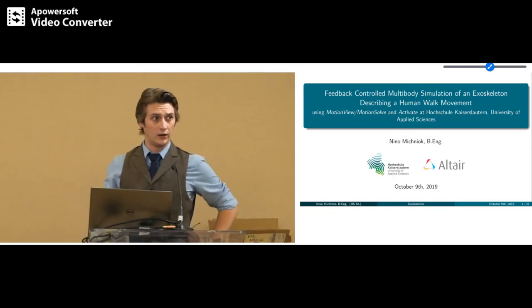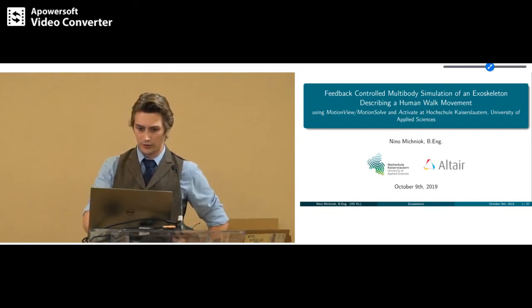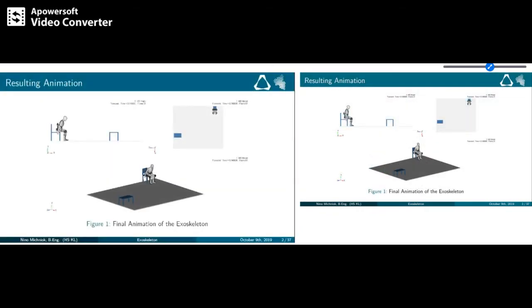Altair and our university collaborate in a lot of projects. One of them is the feedback-controlled multibody simulation of an exoskeleton describing a human walk movement. This is done by performing co-simulation between the software packages Activate and MotionView, MotionSolve. And all the joints are actuated by controllers, in this animation you can see here. These are the final results.